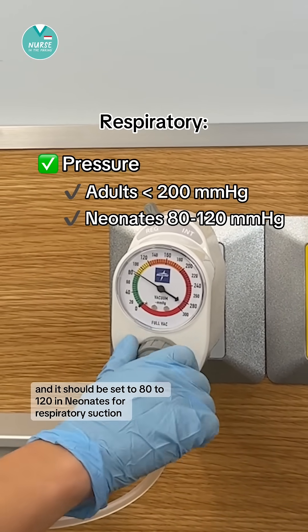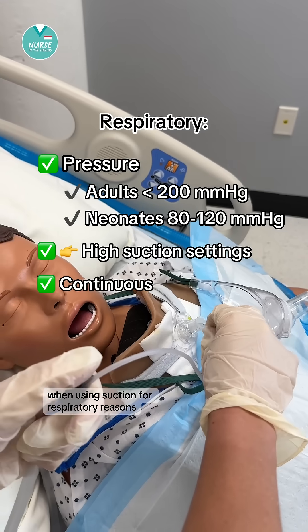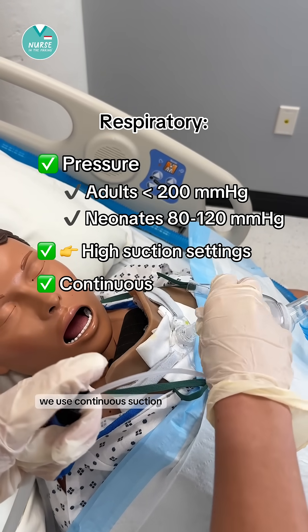In neonates, respiratory suction should be set to 80 to 120 millimeters of mercury. These are all considered high suction settings. When using suction for respiratory reasons, we use continuous suction.